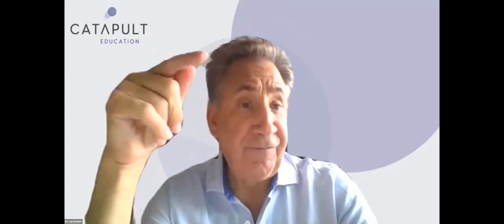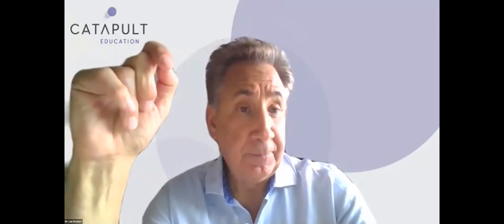Jeff, final comment before I move on. Okay. I've been doing this for 20 years. And when I started doing it, I was taking out lots of caries. And gradually I've been pulling back a bit, and now you talk about removing the mush. Removing the mush, I do with a dental explorer. So I run a dental explorer around the cavity. I get out the seeds that get in there, the bits of food, the blood, pus, and all that sort of stuff.